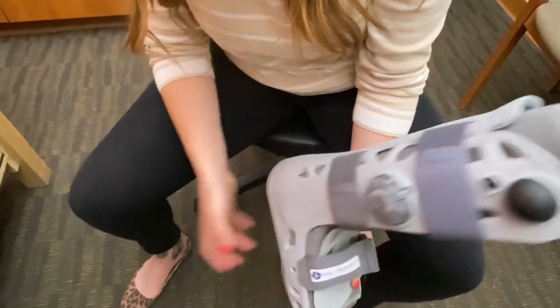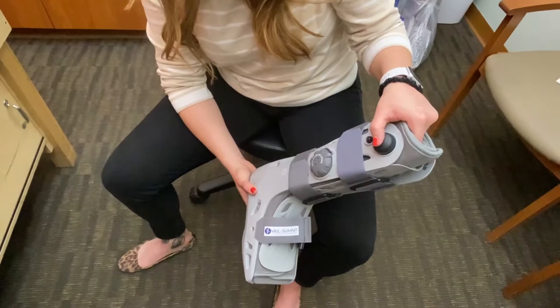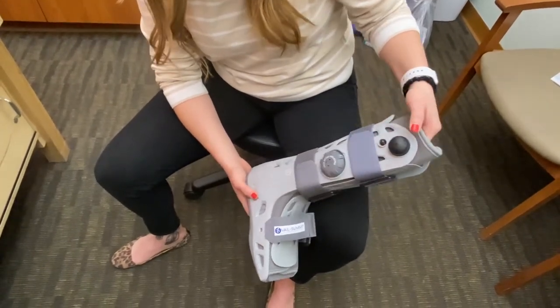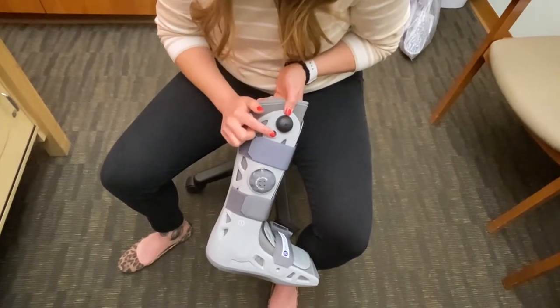Whichever number is in the groove is the chamber that you're working on. This is designed to fill any spaces that are left over after you get secured in your boot. You'll inflate with the big bulb and deflate with the little bulb.